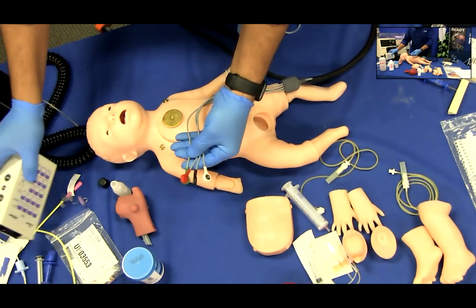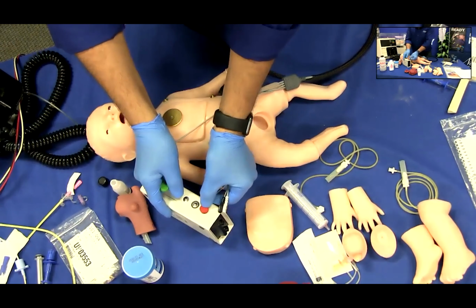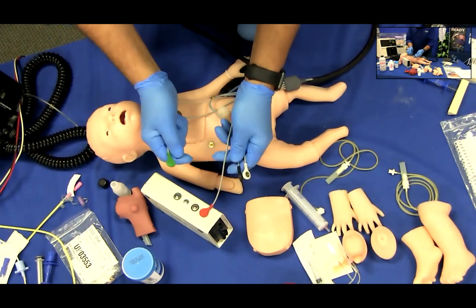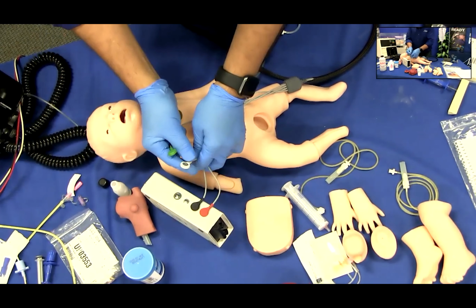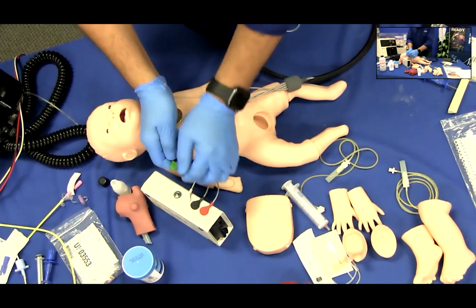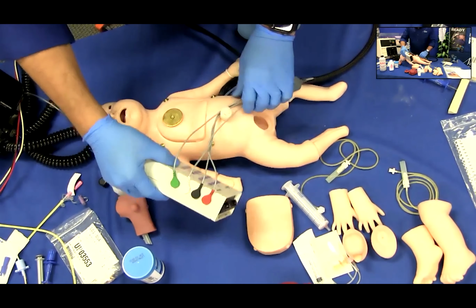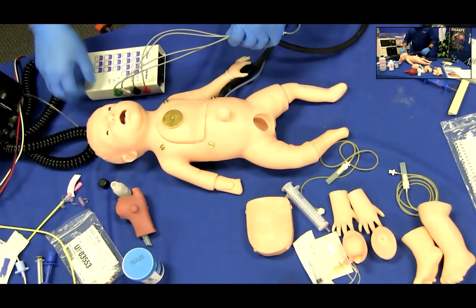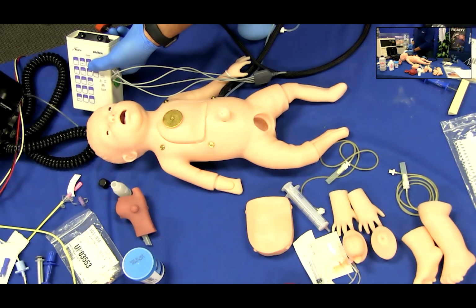Connect the 4 colored limb leads coming from the left side of the infant simulator to the same colored snaps on the side of the ECG simulator. Now connect the limb leads from your defibrillator or monitor to the appropriate anterior sites on the infant simulator.